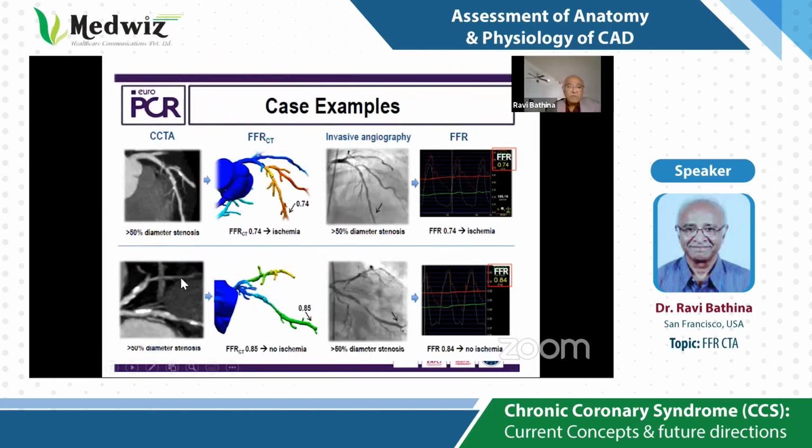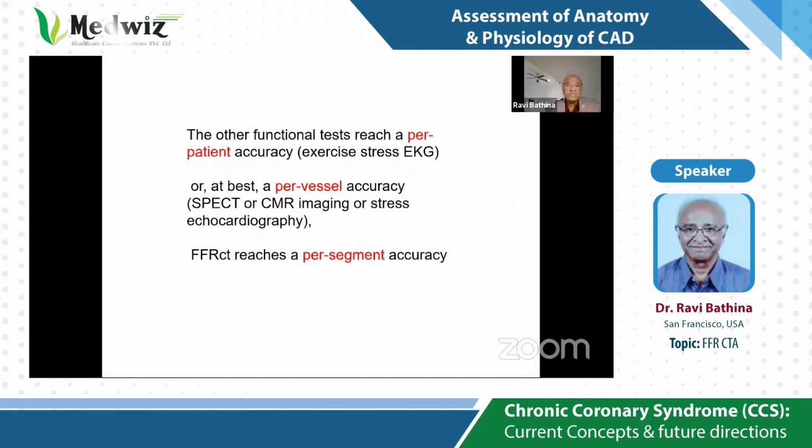The lower panel shows a similar lesion, more than 50%, but FFR CT non-invasively shows it's non-functional, non-significant. Same thing was proven by FFR CT and invasive cath. The point of this slide is we can go by doing everything non-invasively and preventing invasive procedures.